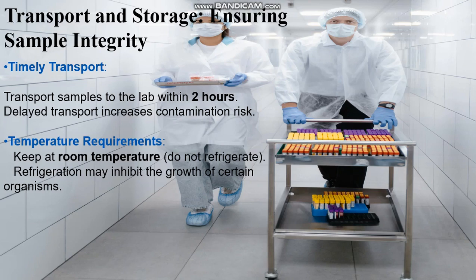Proper transport and storage of blood culture samples are crucial to maintaining the integrity of the specimen. First, ensure that the samples are transported to the laboratory within 2 hours of collection. Delayed transport not only increases the risk of contamination but also compromises the viability of certain pathogens.